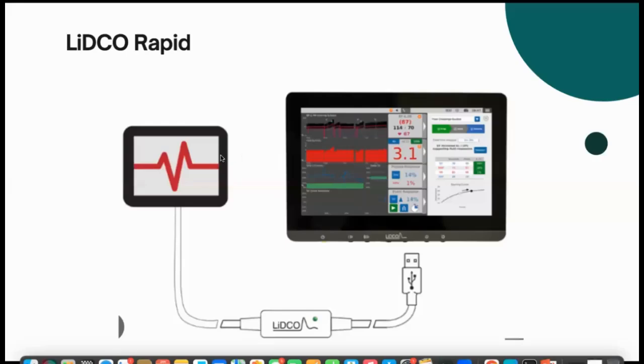So hope you all can see the screen. So we are at LIDCO now. LIDCO is available for us in the hospital. Again, it is a kind of arterial line. Through an arterial line, we take the input, and there is a processor, and then it is given as derived numbers on the screen, and this is LIDCO rapid.